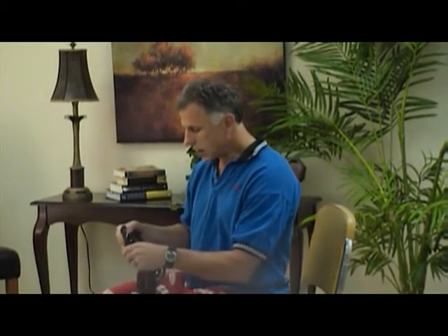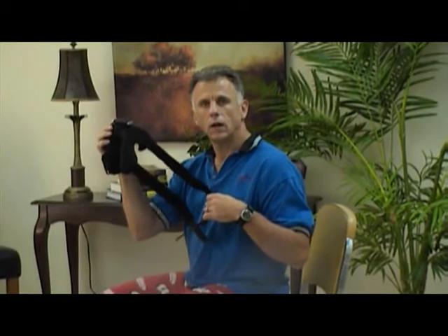One of the analogies I use is if you burn your finger on the stove and you put it under some cold water, you feel the cold water running over it, not the burn anymore. It feels much better. That's a similar analogy of how a TENS unit works. You feel the E-stim versus the pain, and it's much more comfortable. So let's go on to how this particular unit works.